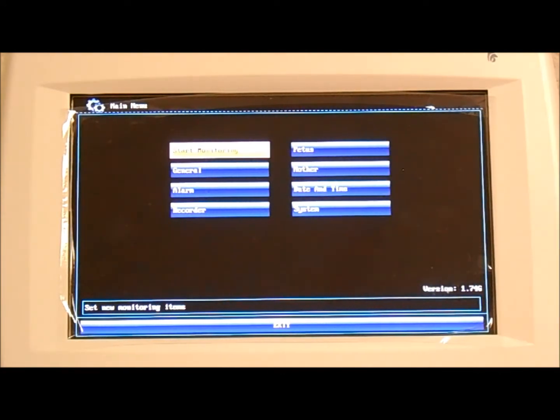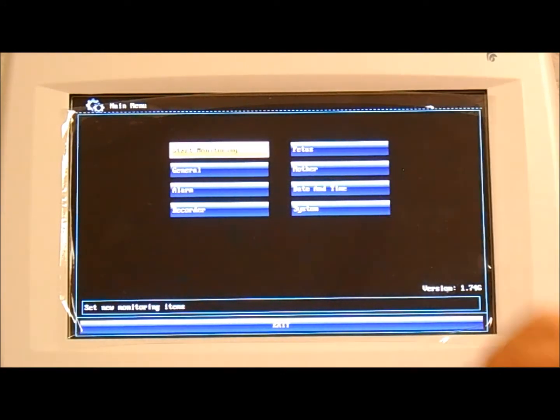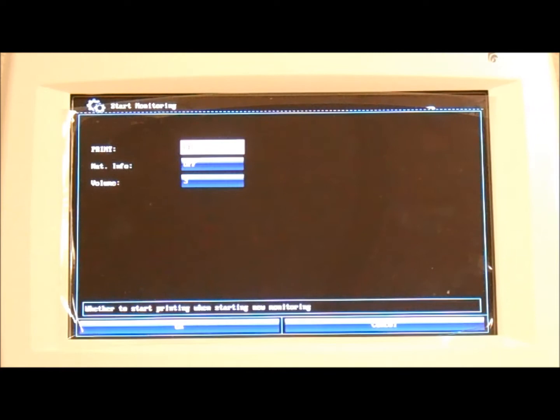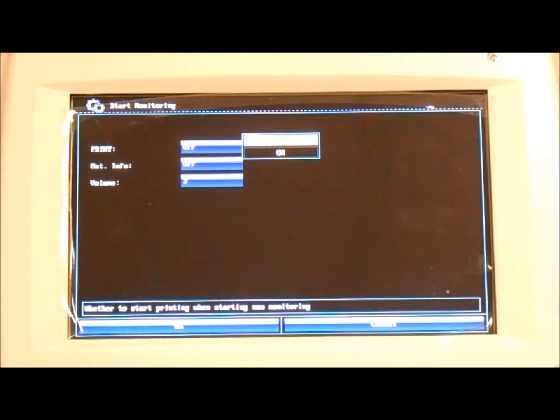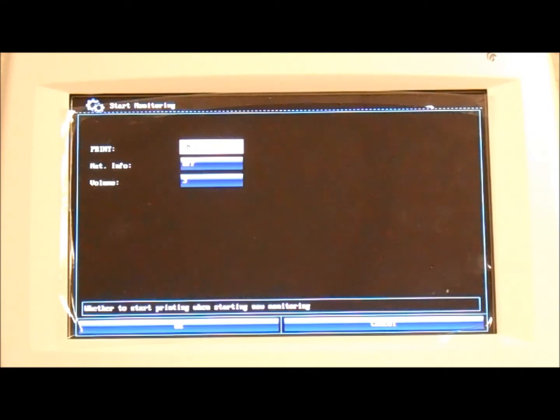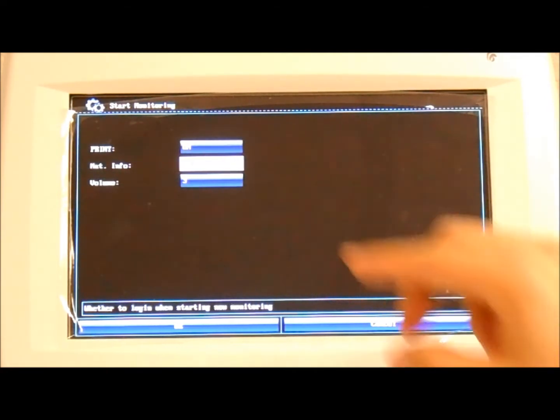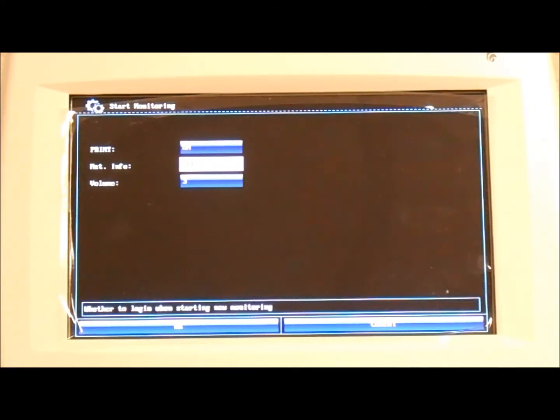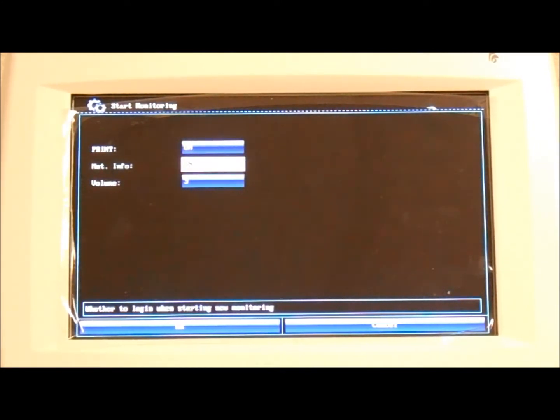The first tab is Start Monitoring. Through this menu, we can adjust what happens when we press the Start key. The first setting is Print. If it's set to off, the machine is going to start a new patient, but it's not going to start printing automatically. If we set it to on, after we press Start, you start a new session and the system automatically starts printing. Maternal info, if it's set to off, after pressing Start, the system is not going to ask you to enter the patient name. If it's set to on, it is.